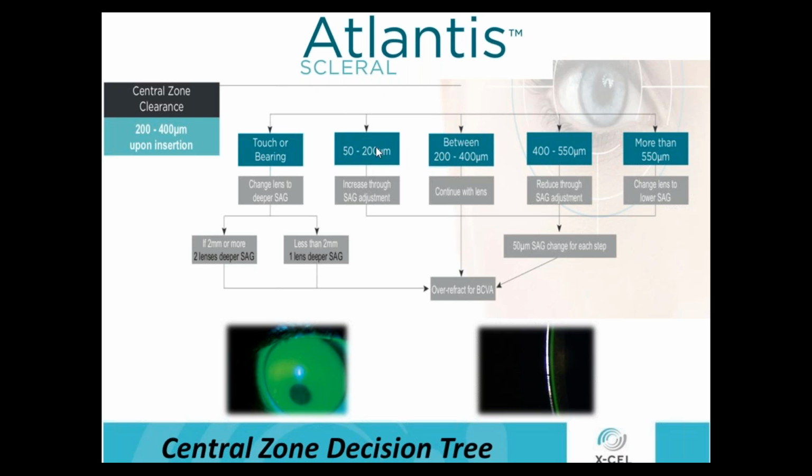Of course, you can use the consultants for this, but this makes it very quick and easy to see what you have. You have your goal over here to evaluate your situation, and then what is my step, or how do I move on from that situation and create my next lens, or at least in this zone, what do I change? So a nice decision tree for that.